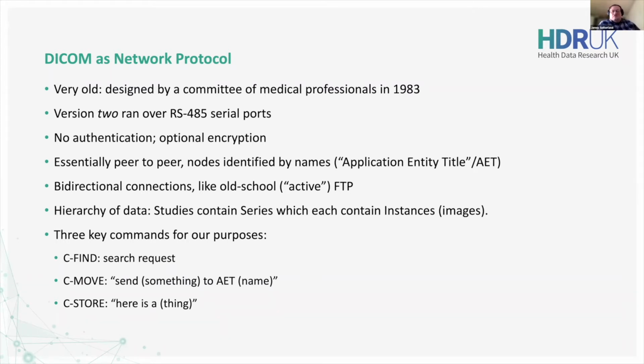And then once you've found or identified your target, you can send a C-move request, which asks the PACS on the other end to send a particular scan or set of scans somewhere, which will be to another AET, another PACS node, usually yourself, but the way the protocol is set up, it's not necessarily you. The idea was that, for example, you can equally easily ask for scans to be sent from your hospital's PACS to another hospital or another department that has a separate PACS, and that works in exactly the same way. And there's the related C-store command, which is how you upload data. When you send the C-move command to the PACS, it will respond to that, assuming that the request is accepted and works properly, by sending a series of C-store commands to the destination PACS, which transfers the actual data.